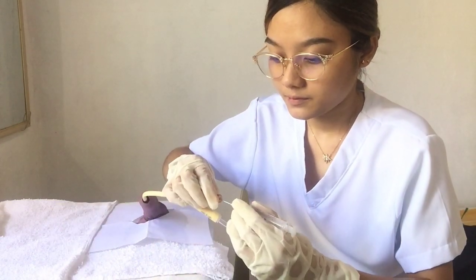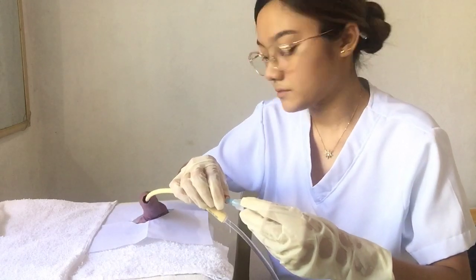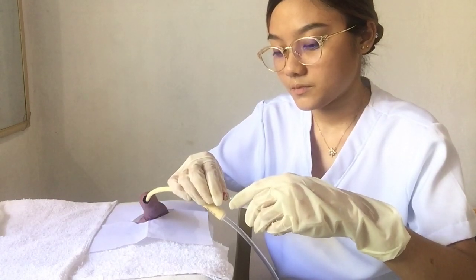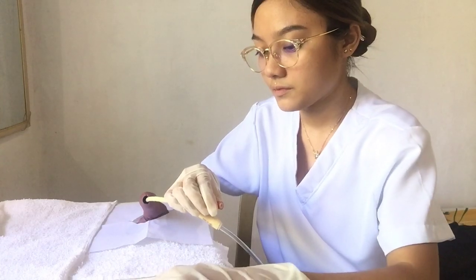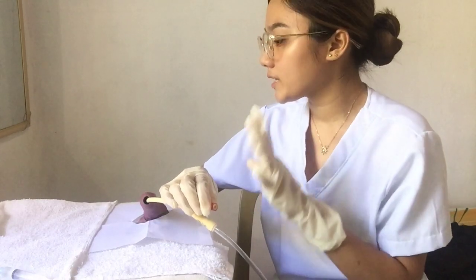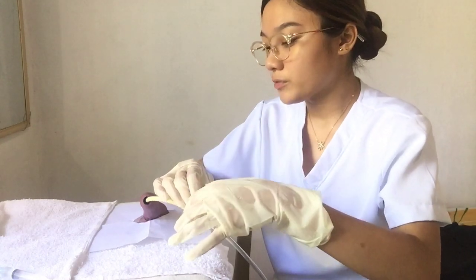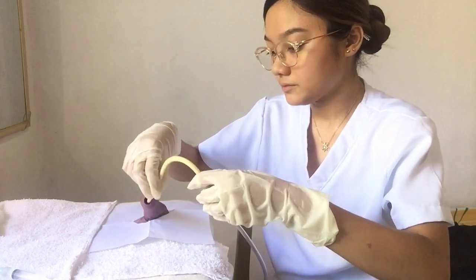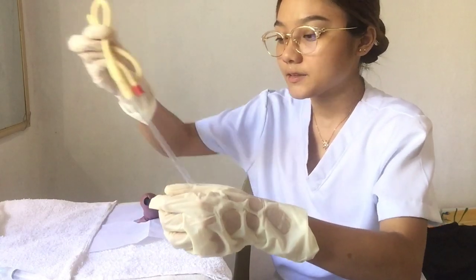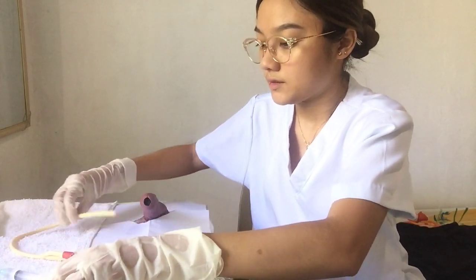Ask the patient to breathe in and out deeply. Pinch the catheter and remove it slowly, asking the patient to exhale gently as it is removed. Place the removed catheter on the waterproof pad. The catheter has now been successfully removed from our male patient.